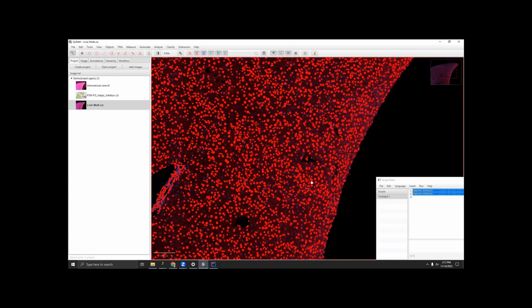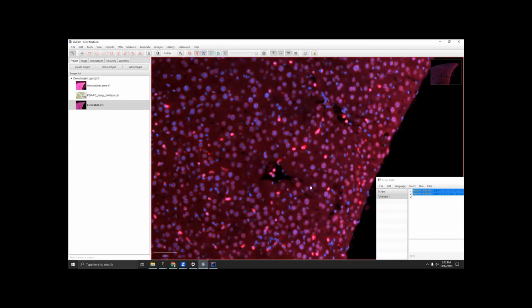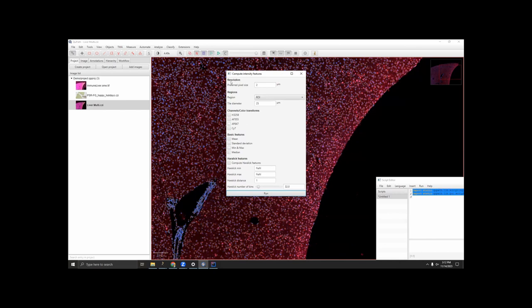Next, we need to actually measure the background artifact around every cell. So to do that, I'm going to go to select detections, select cells. And you can see these are all highlighted. And then analyze, calculate features, add intensity features. By default, when you load up this window, it assumes you want to measure the region of interest, but instead I want to measure a circular tile with a diameter of 25 microns around each region of interest.